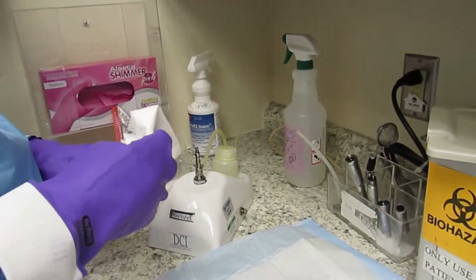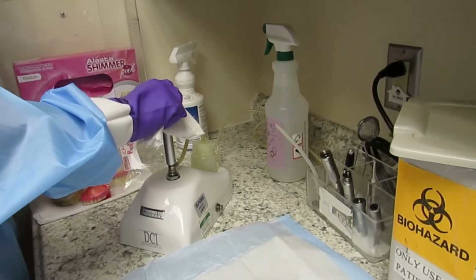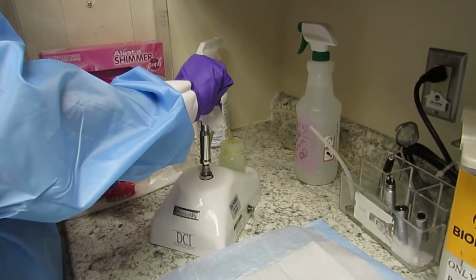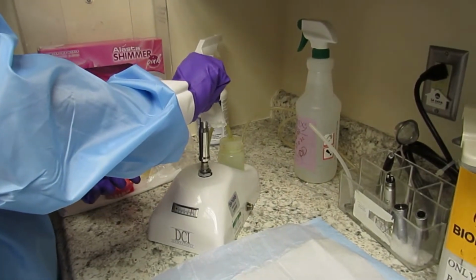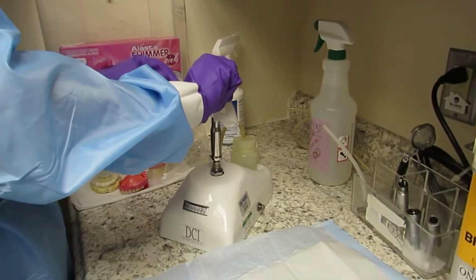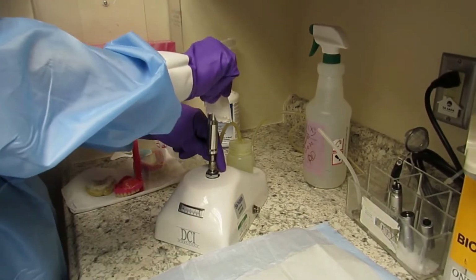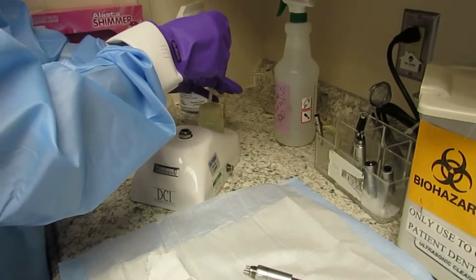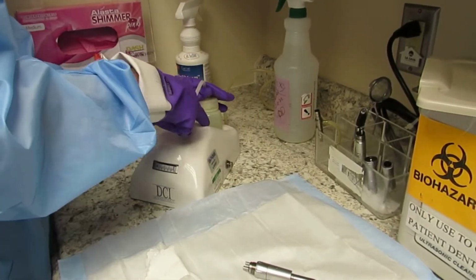After the 15 minutes is up, the handpieces will be flushed or purged on the DCI flushing system for 30 seconds at a minimum of 80 psi to expel all excess cleaning solution. Remember to use the correct handpiece adapter.